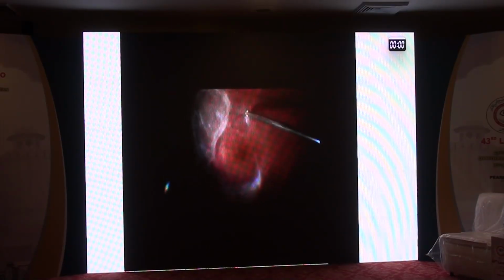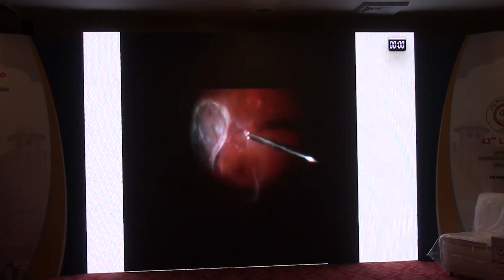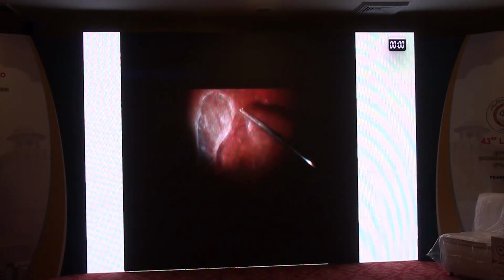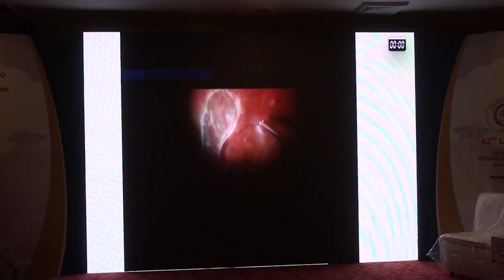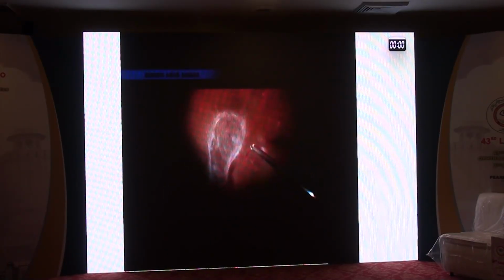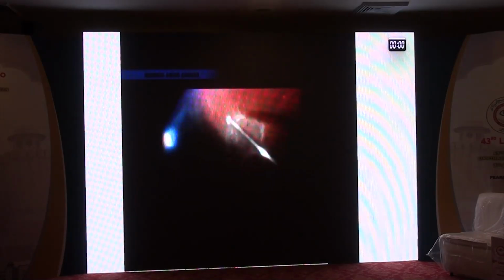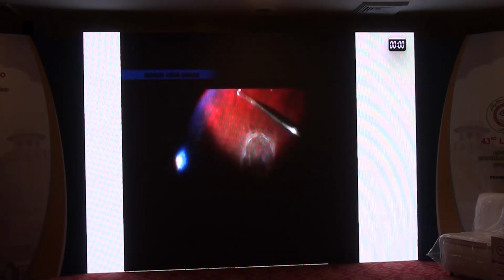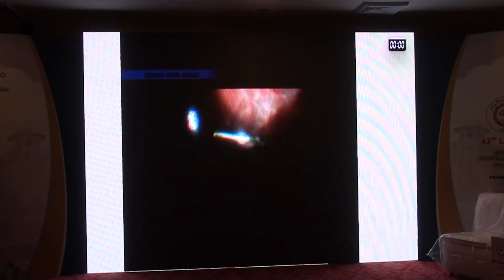I do this approach only in those cases where the retina has already detached from the vitreous in the peripheral part of the retina. Here the vitreous has been separated, and we are moving all around so that it is free from the FVPs, flattening down the retina.